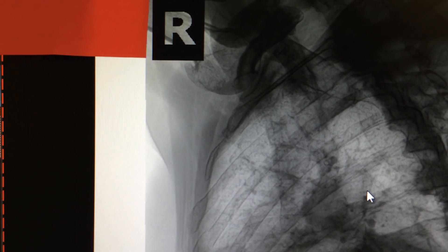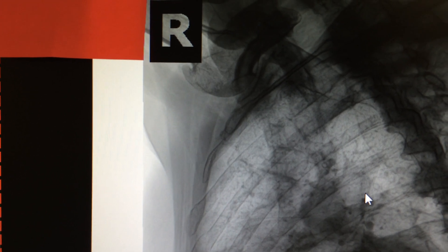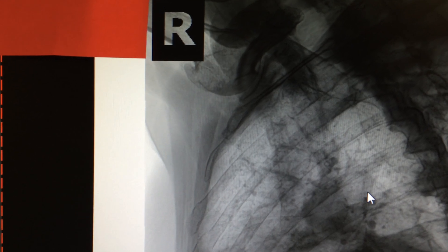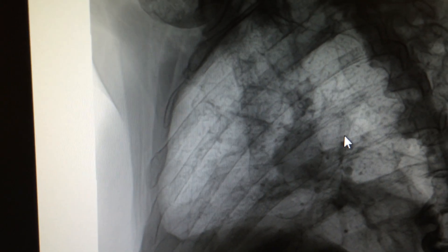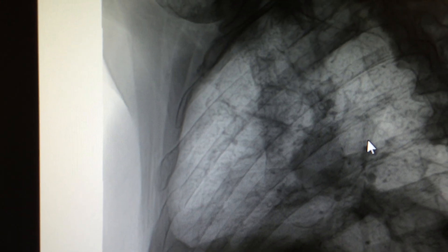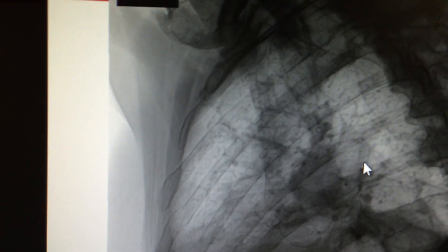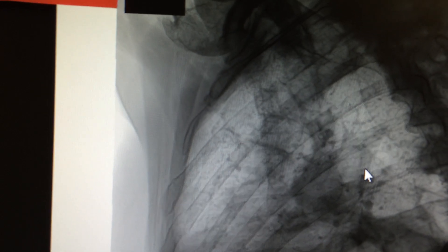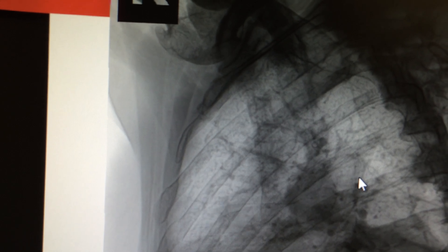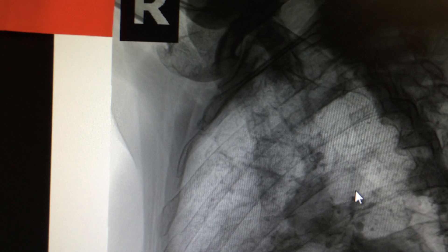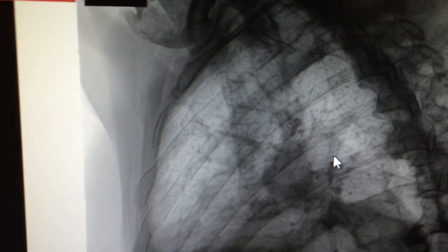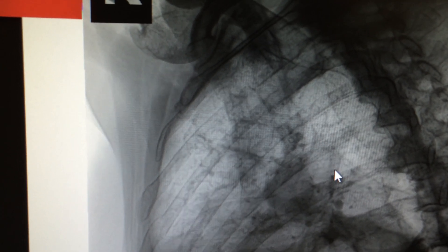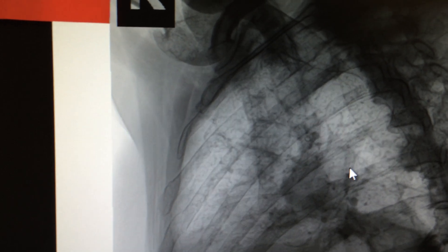The most commonly fractured ribs are the 7th through 10th ribs — as seen in this case with the 7th rib fracture. Ribs 8, 9, and 10 are attached to the 7th rib, while ribs 11 and 12 are free-floating. The 7th rib is at particular risk because ribs 8, 9, and 10 are attached to it, and that attachment increases the fracture risk for the 7th rib.